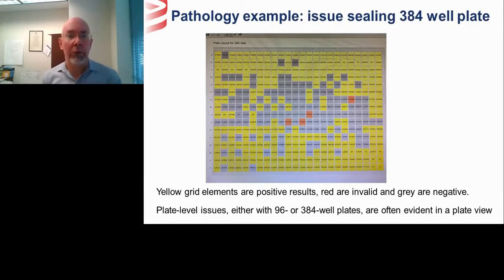And there's a very aggressive vortexing step that's required in this assay immediately prior to RT-PCR to ensure that the RNA template and the master mix are well mixed. And so by not having those seals at the edges of the plate, there was just enough positivity to bridge across. If you have an adhesive seal that's not fully sealed, it becomes a wicking bridge to transport sample. And so we believe that's what happened in this case. So easily caught, easily understood, easily fixed operationally, and not released. So this was rerun before being released.